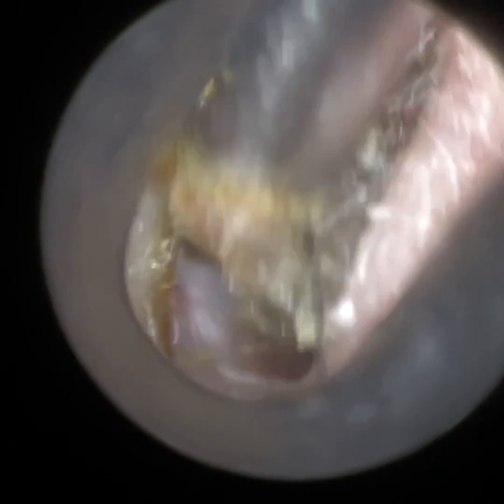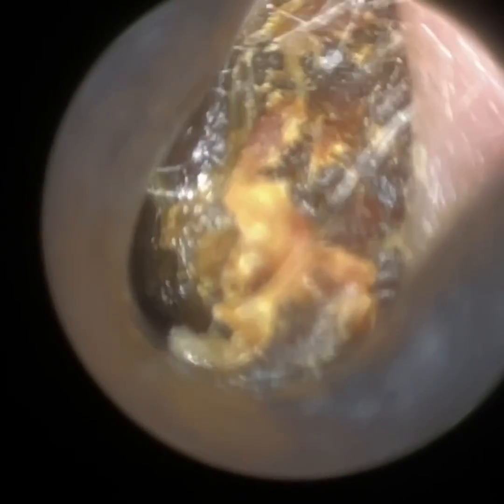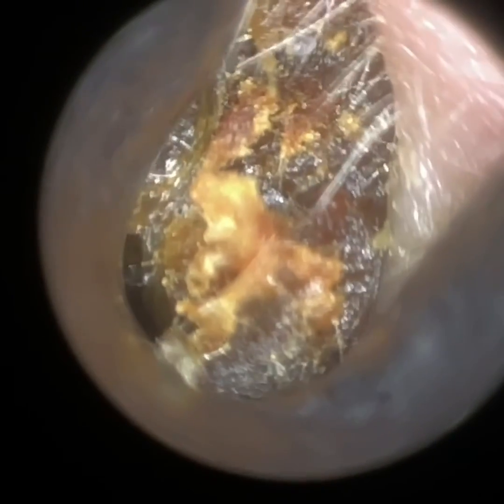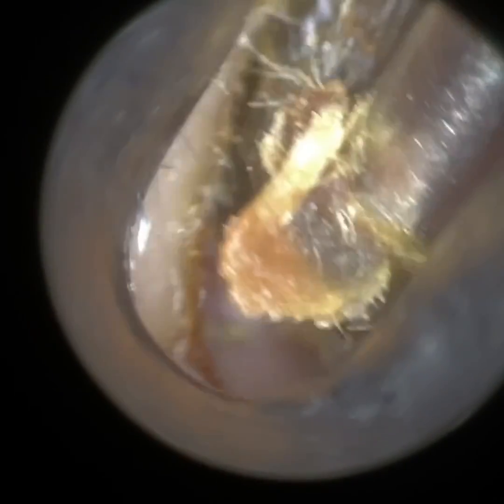The Waxscope comes with different specular attachments at different sizes. This is the 3.5mm, and we've got a 4.25mm which is probably going to be the normal standard size, then a 5mm and a 5.75mm. With the iClearScope endoscope, you're having to use it to dilate, straighten and widen the ear canal, whilst simultaneously using your dominant hand to hold the earwax removal tool to extract the earwax.